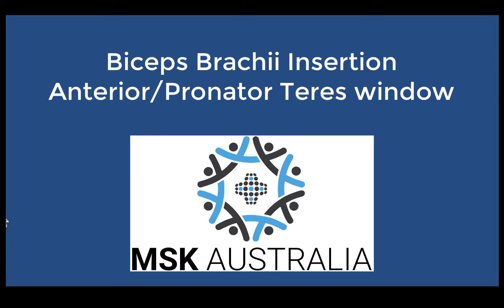In this tutorial we're going to talk about the different views that we can use to assess the biceps insertion at the elbow. The first one we're going to come to is our anterior view, or using our pronator teres window, to assess the insertion of the biceps brachii.